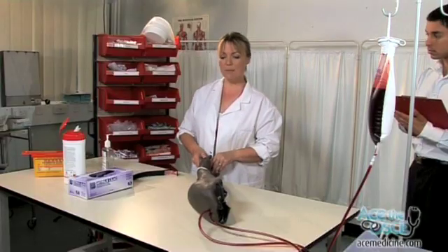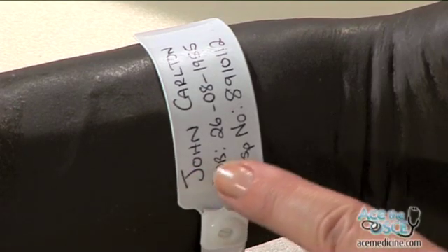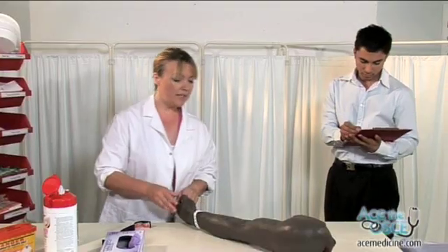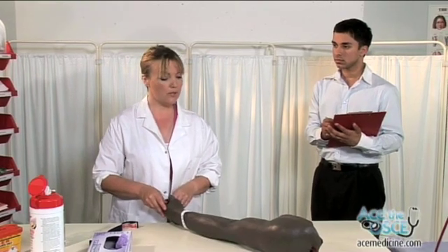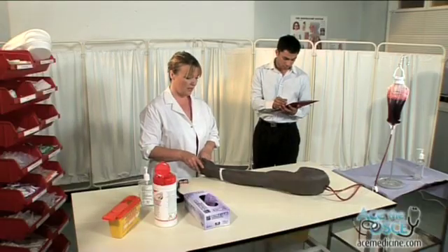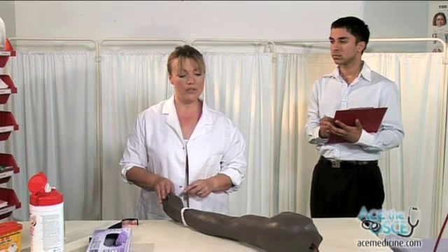Hello sir, my name is Deidre Wallace, one of the medical students. Can I just check your name? I need to put a cannula in your arm today in order to be able to give you some intravenous antibiotics. Is that okay? Have you had this done before? I'm just going to get some equipment.